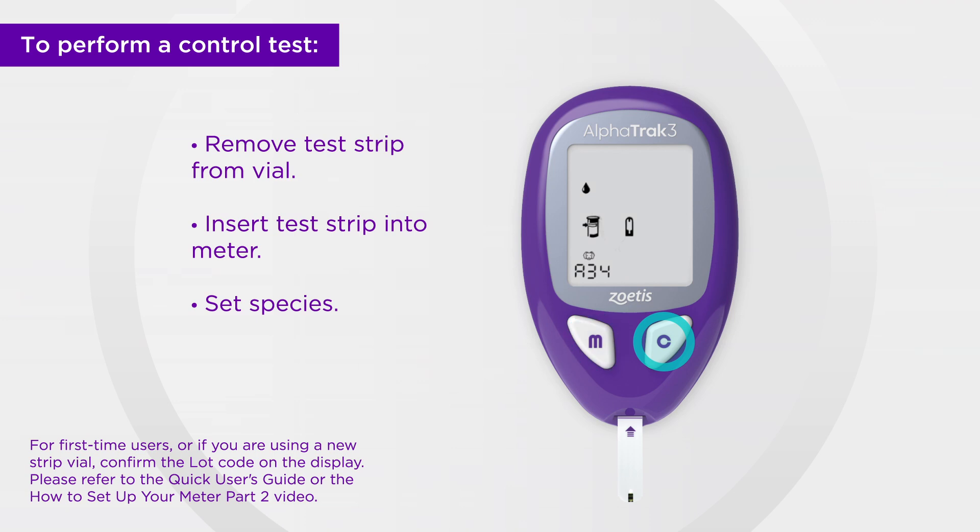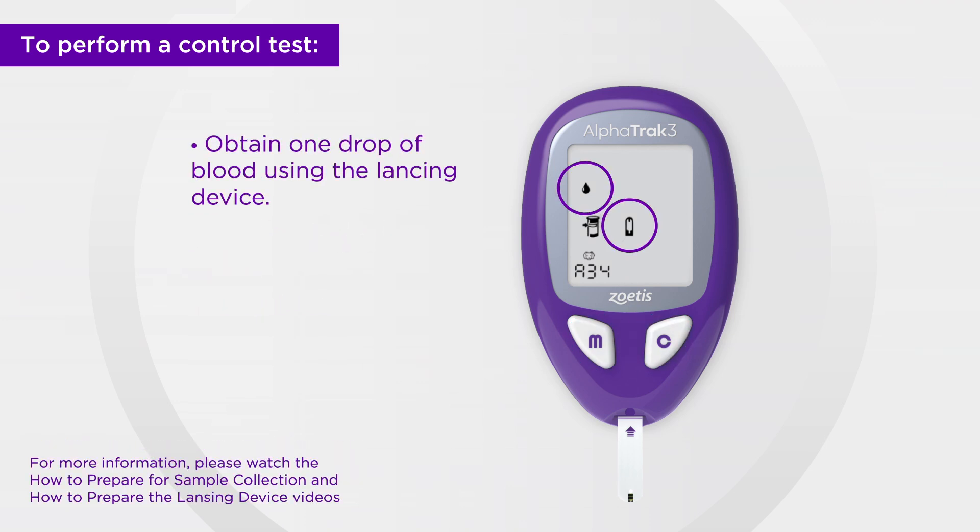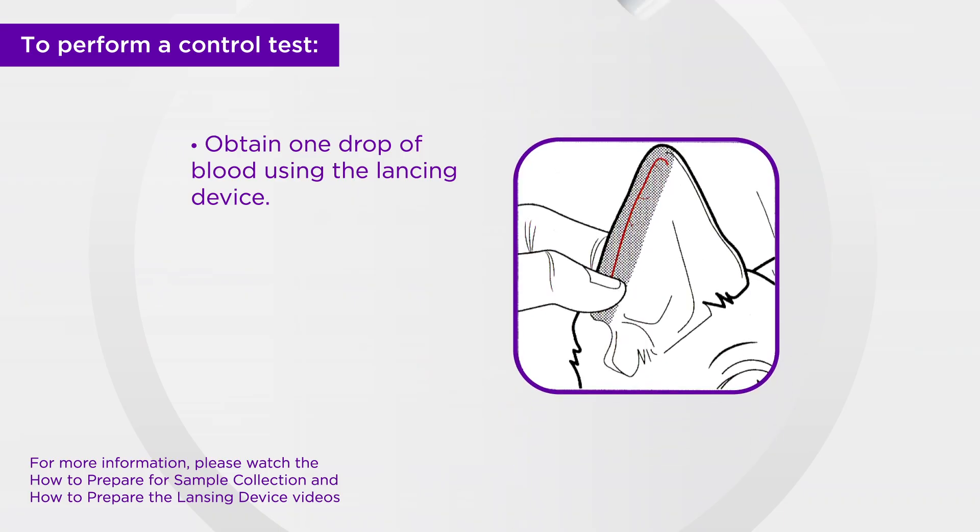When both the blood droplet and strip icons appear on the display, use the lancing device to obtain a drop of blood from the prepared sampling site.